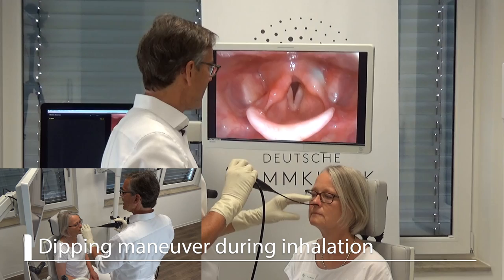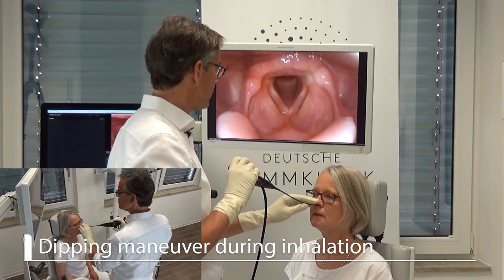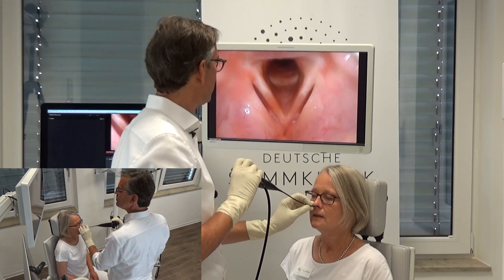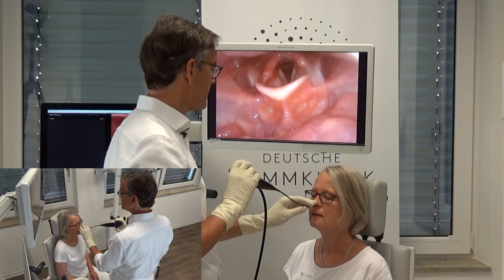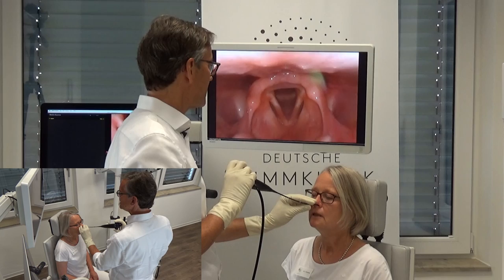If the image is blurred, I ask her to swallow, and because it's numbed I do have a couple of seconds — if not minutes — to do all these procedures. Again: first exhale through the mouth, and now I will occlude the other nose and inhale through the nose. Again, and then before she is done with inhalation I retract the endoscope. Let's do this once more — try to exhale as much as possible and give me a long inhalation through the nose as long as you can. I can hear that she is still inhaling but then I have to retract in time.